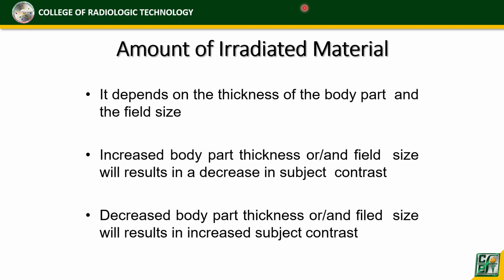Naintindihan po, kapag manipis ang body part at mas maliit ang field size, mas maganda or may increased ang subject contrast. Okay?